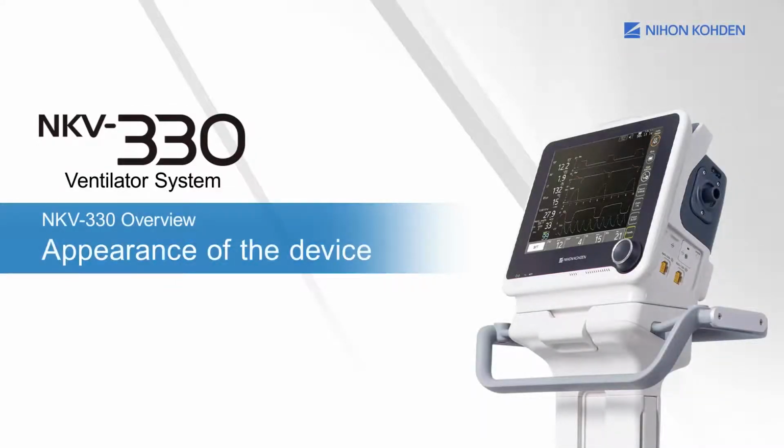This chapter explains the exterior of the NKV-330 ventilator.